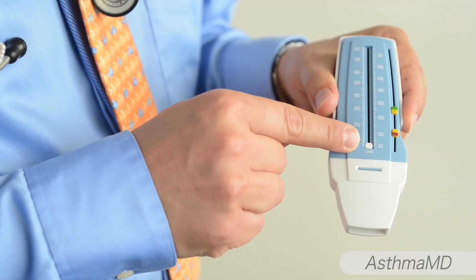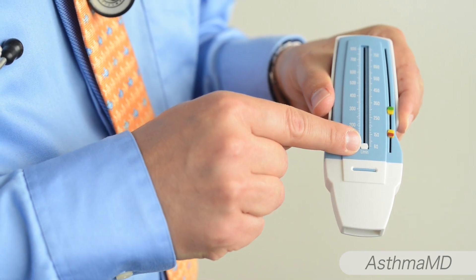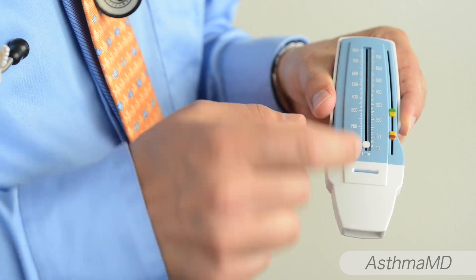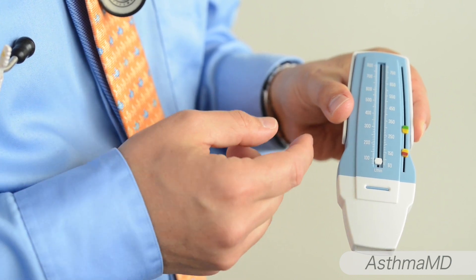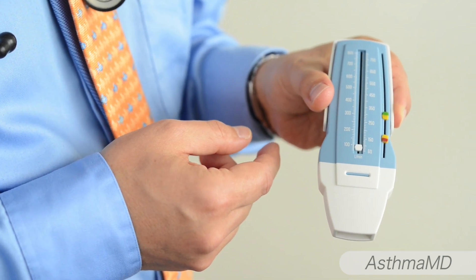Here I'm going to show you what the peak flow meter looks like. The centerpiece has a slider — a white slider that goes up and points to a number. On the side we have color zones that are also sliders, and they're set by your physician based on your zone, calculated based on your height, age, and sex. Or you can use the AsthmaMD app to automatically set those.